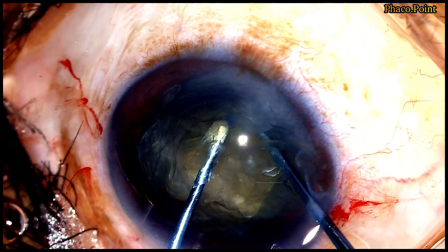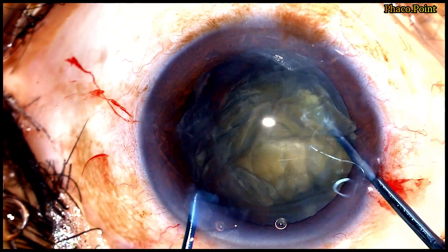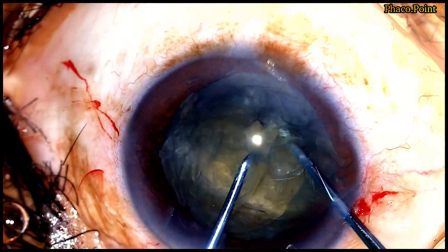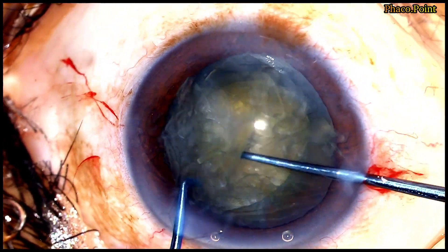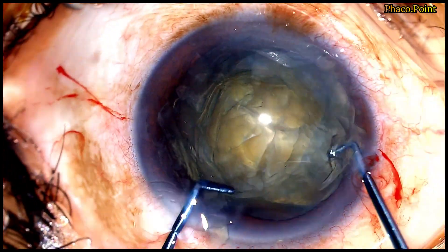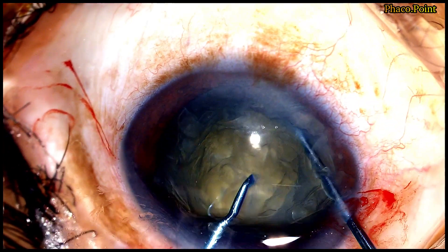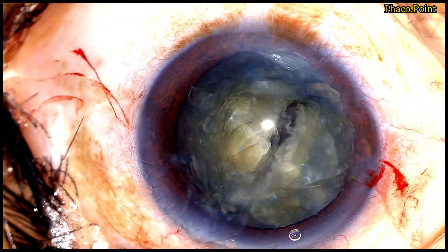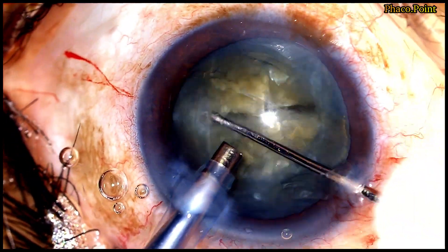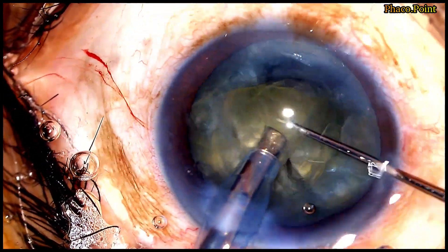You can see how the sustainer holds onto the nucleus while the pre-chopper buries into it; both instruments move towards each other and the hemi nucleus is further subdivided. What I like about this technique is that we are pre-chopping the nucleus within the capsular bag. There is no unnecessary instrumentation in the anterior chamber. The first instrument that goes behind the nucleus is safe because of its bulbous tip and does not endanger the posterior capsule. Once downsized with significant ease, you can see how the individual nuclear fragments, so perfectly well demarcated, are easily emulsified.